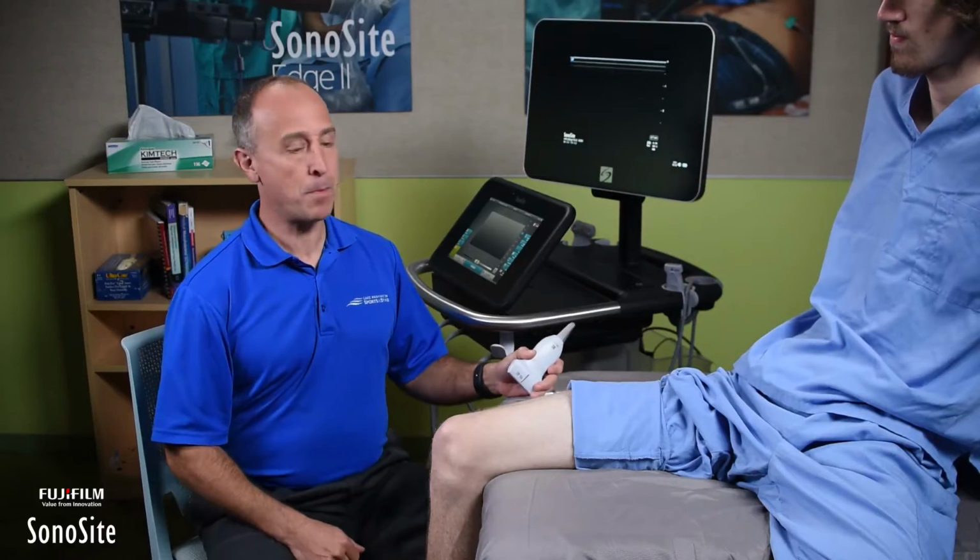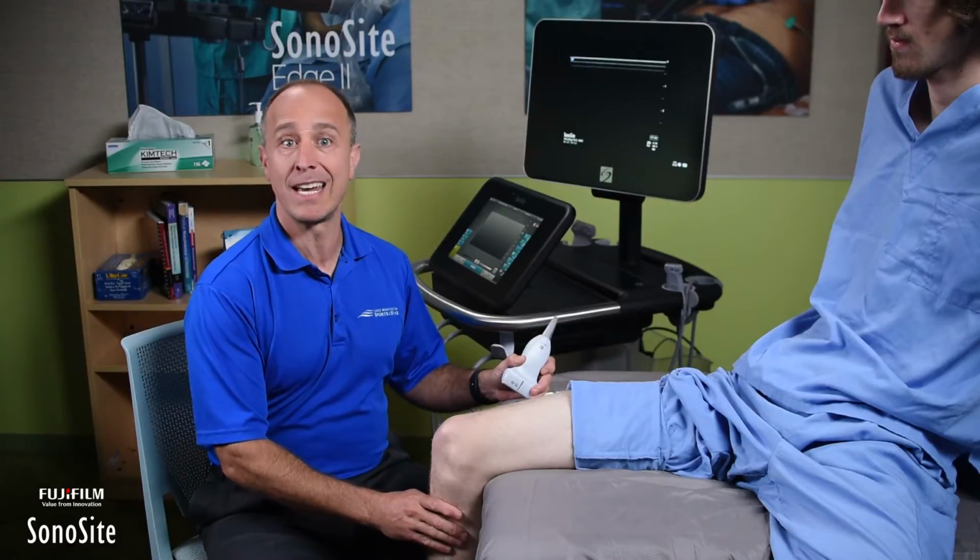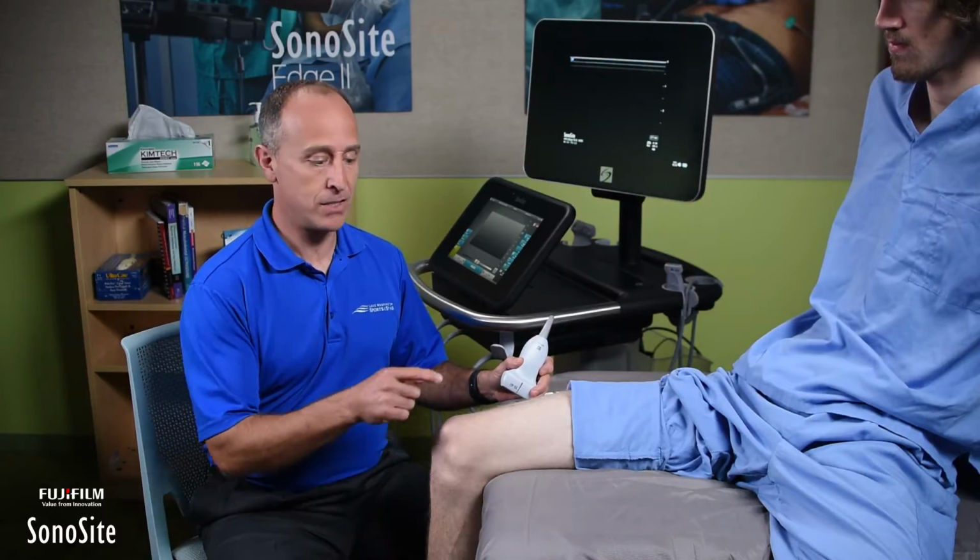Hi, I'm Garrett Hyman from Lake Washington Sports and Spine in Bellevue, Washington, and I'm going to talk about some dynamic scanning of the knee joint. So we have here Jacob, our model. He's in a seated position. This is ideal for looking at the suprapatellar recess of the knee.